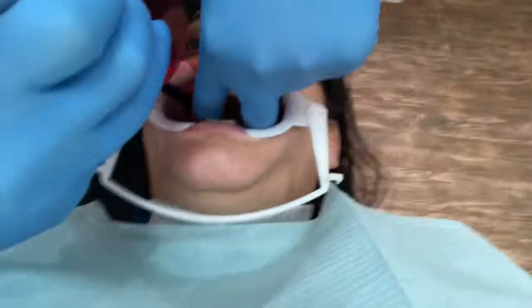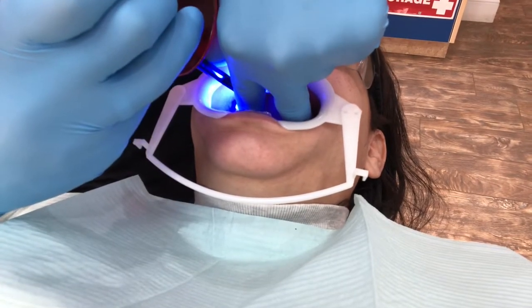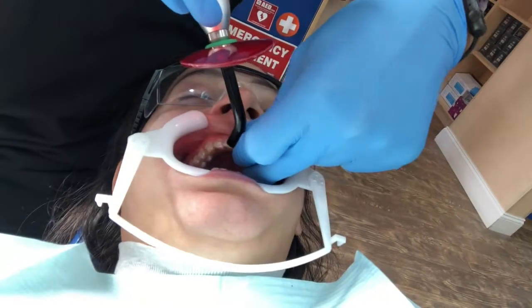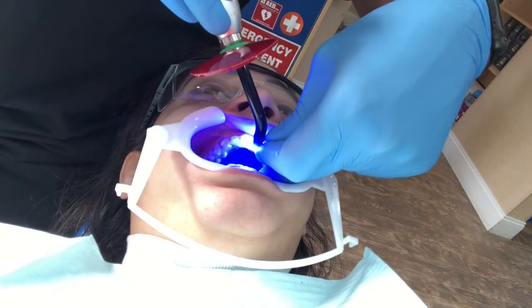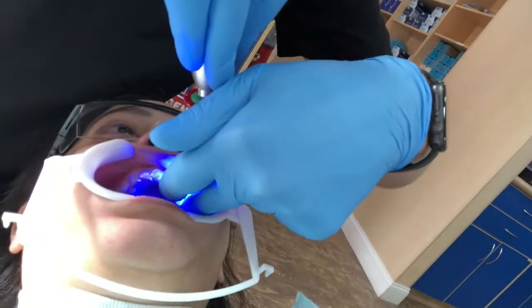Like I said, the edges are a little sharp, so get a nail filer and just file a little bit away. You can probably feel it with your fingers — try to file it out but don't do too much. So far they are a lot to get used to, but it's not bad.